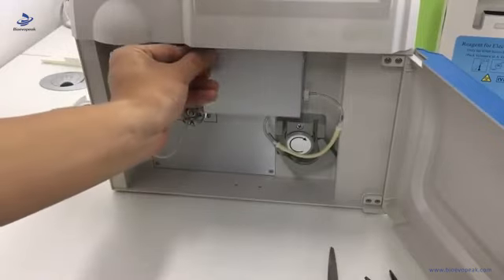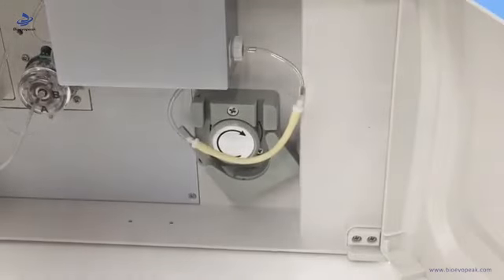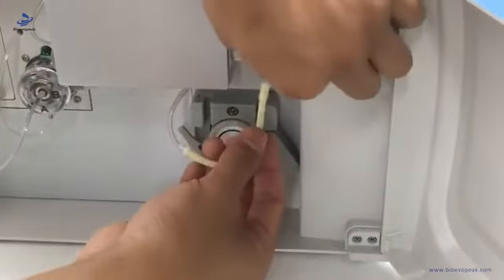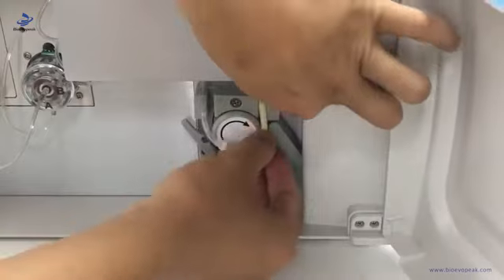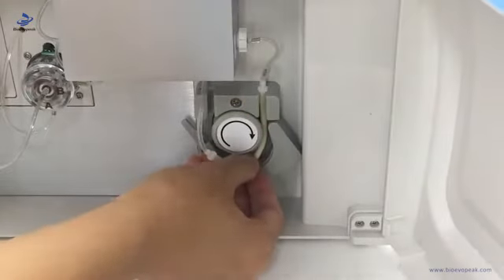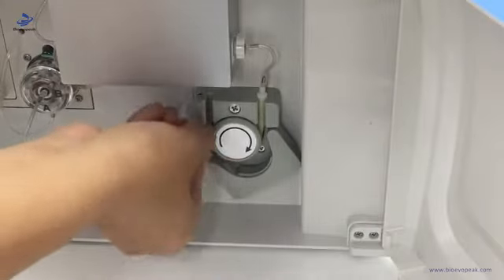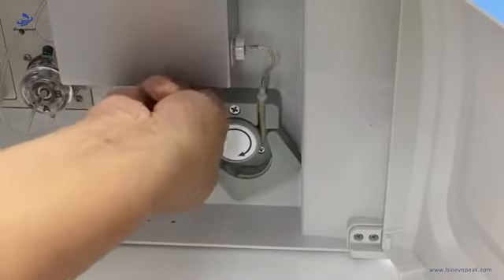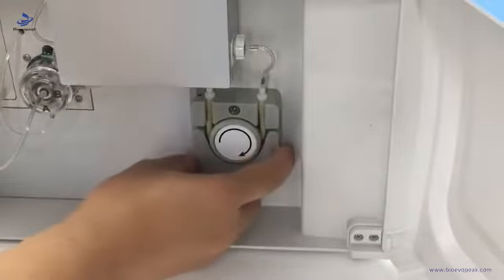Then close the door. Now let's install the pump tube. Hold the pump tube and put it in the slot, then pull it around the pump head, pull it, put the other end at the slot, then lock it.